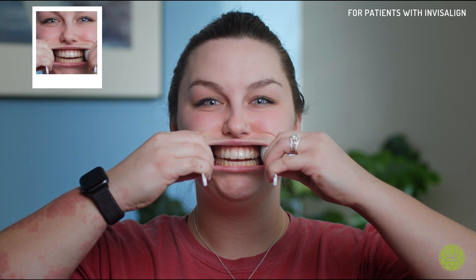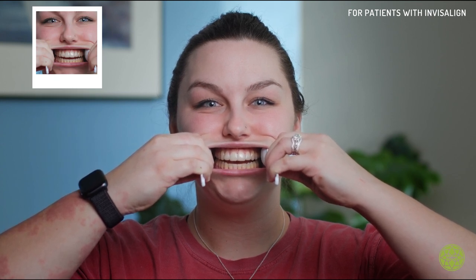These next photos are for our Invisalign patients and the ones wearing clear retainers. You're going to want to make sure that you have your aligner or clear retainer in, using your spoons again putting them on either side of your cheek, pulling out but not biting down all the way. We're going to want to make sure that we can see the edges of your teeth inside the edges of those aligners or your clear retainer to make sure things are tracking.